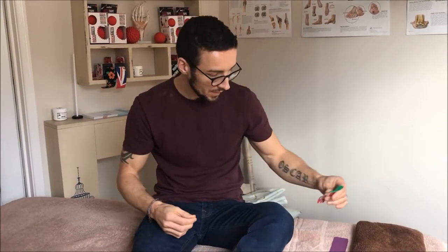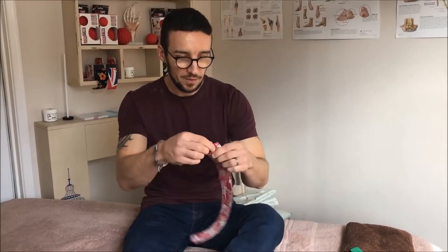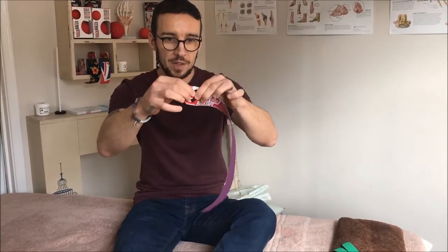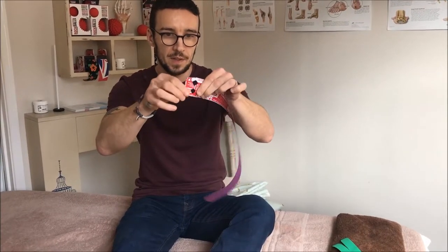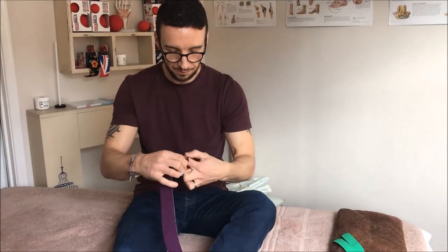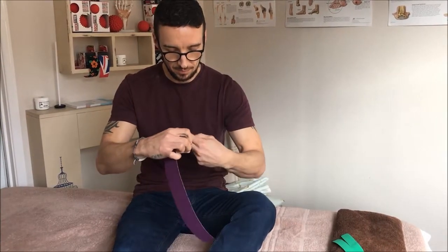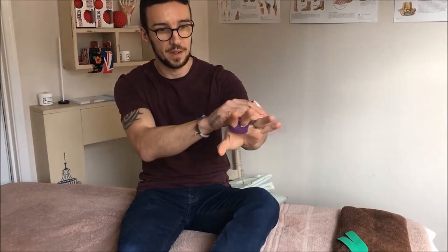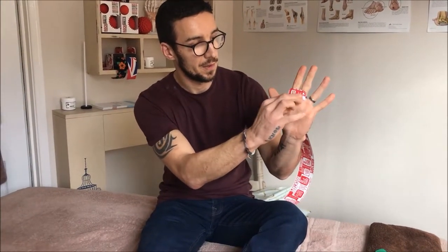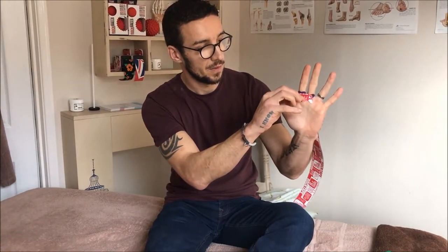Where the finger holes are, break the tape and feed your fingers into the holes so your fingers are set like that. Then remove the backing of the tape and stick it down just below your fingers.